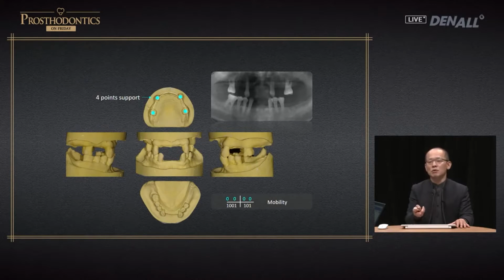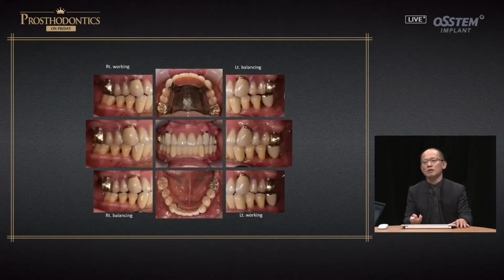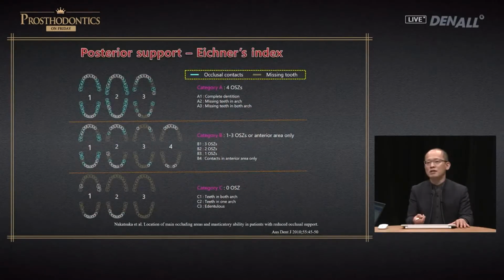So what needs to be considered is that even removable, you can create as powerful as fixed ones, and with the fixed bridge with the use of a few implants, you can easily solve a lot of challenges here. So although yes, it's full mouth rehabilitation, it's the easiest and simplest rehabilitation. Removable and fixed are both used, but for the patient, it's closer to using removable. So it's an easy case.